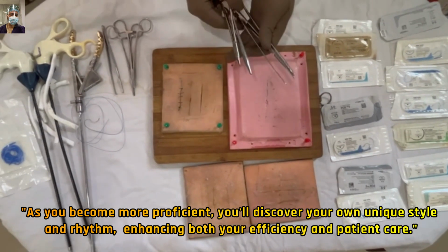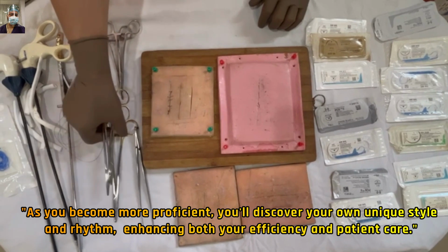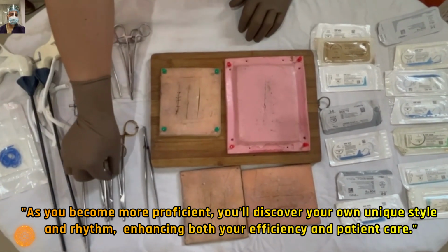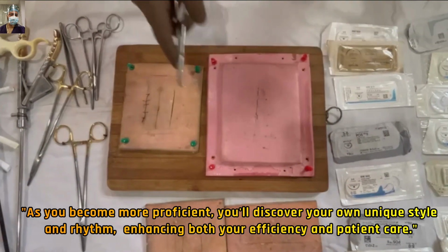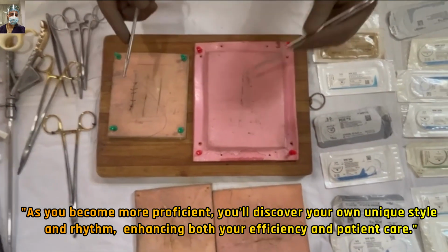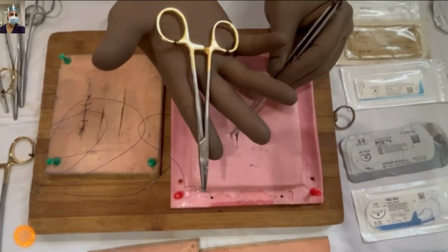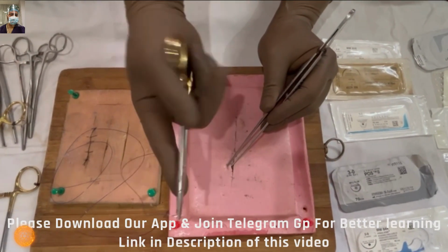So let's start with how to tie the knot with the help of instruments. Simple interrupted suture is the cornerstone of suturing, and most of the sutures will be simple interrupted. So I am using the palmar grip. Notice and practice how to hold the needle holder. This is a short needle holder. While you are suturing on the surface, short needle holders are good. Otherwise, for depth, long needle holders are required.